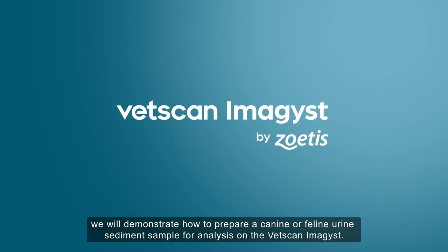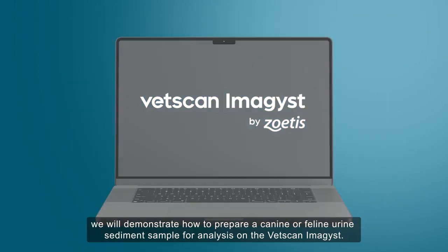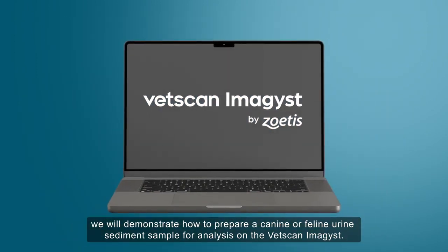In this video, we will demonstrate how to prepare a canine or feline urine sediment sample for analysis on the Vetscan Imagyst.